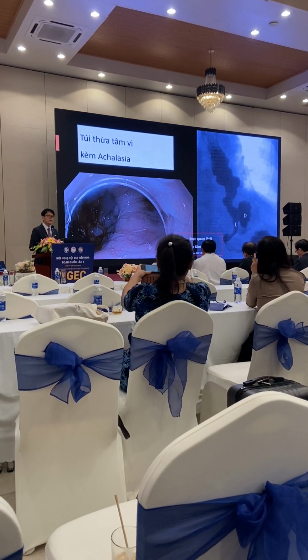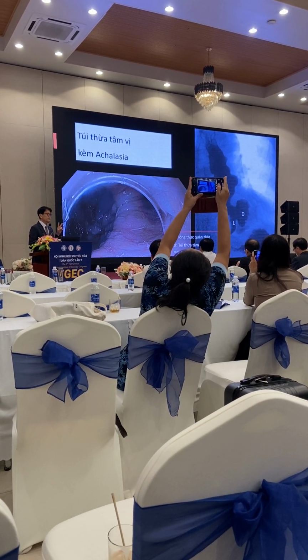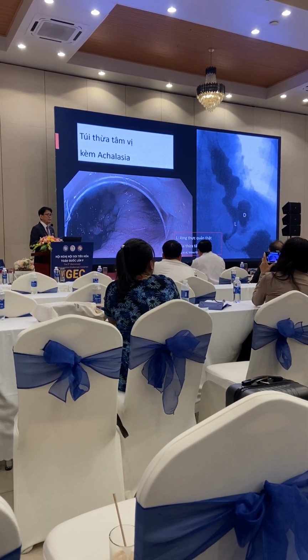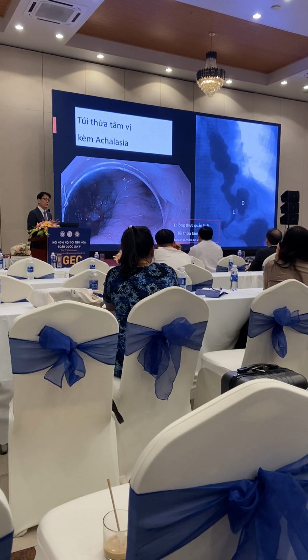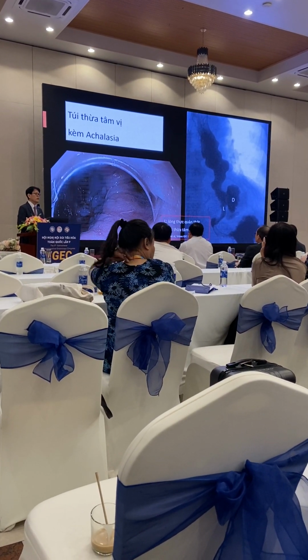Let me introduce achalasia, but not common achalasia. There are two specific sequelae after long-standing achalasia. One is the epiphrenic diverticulum. Again, this is not the traction type, this is the pulsion type. So the pulsion type means we can treat it by endoscopy, like a Zenker, we can treat this.